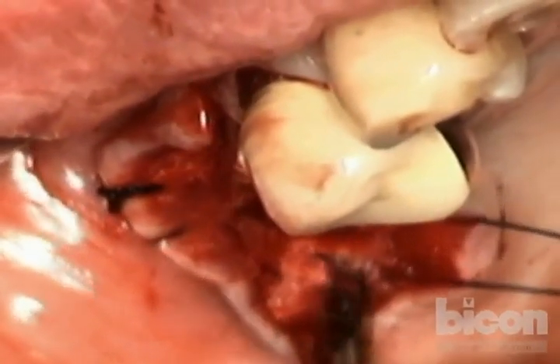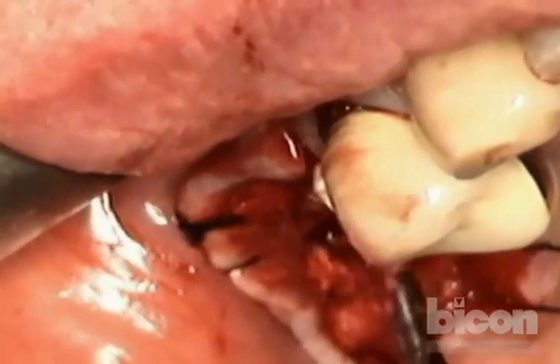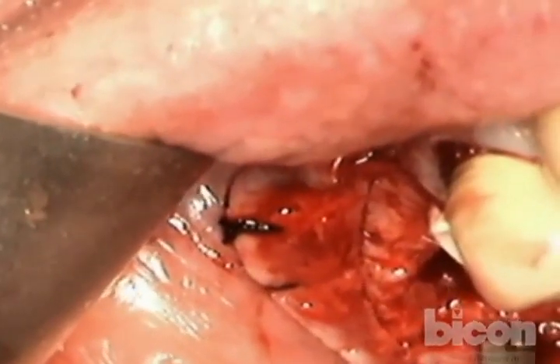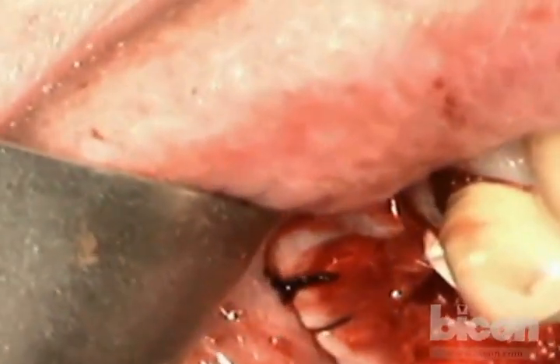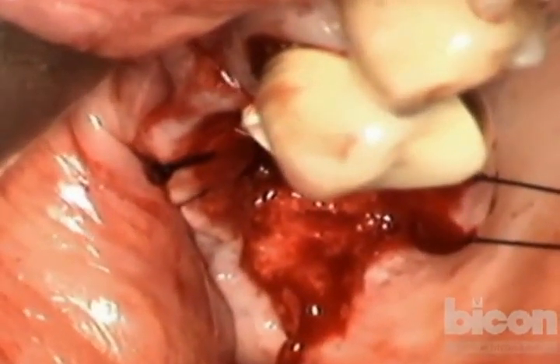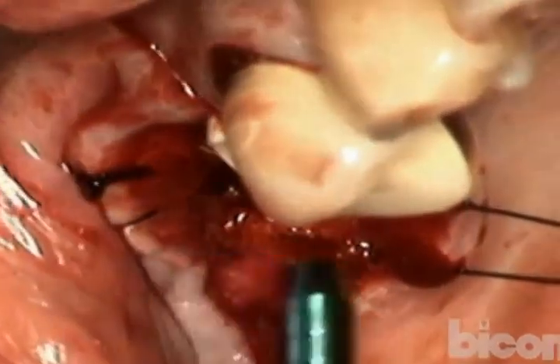Okay, and all I need to do is go in approximately 6 millimeters, which is the depth. So now I will go to hand reamers and do the whole osteotomy with hand reamers or with site expanders. So the posterior one will start here. Okay. And since I already know, hold this please, Jenna. I already know that the window has given me a significant width, so I won't need to start with the reamers for the mesial implant until I reach the size of 3.5 or 4. So I will continue with hand reamers.